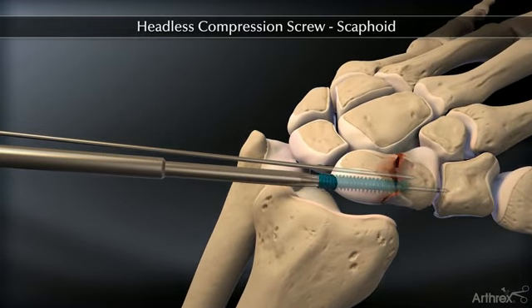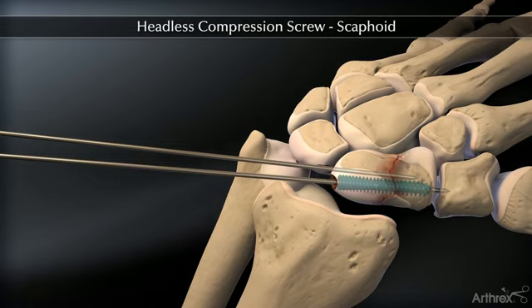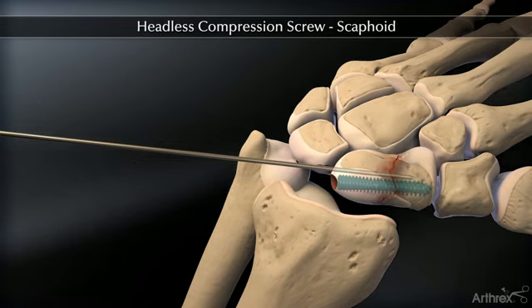Confirm placement and length of the screw on imaging, ensuring that both leading and trailing edges of the screw are beneath the articular surfaces. Finally, remove the guide wires.